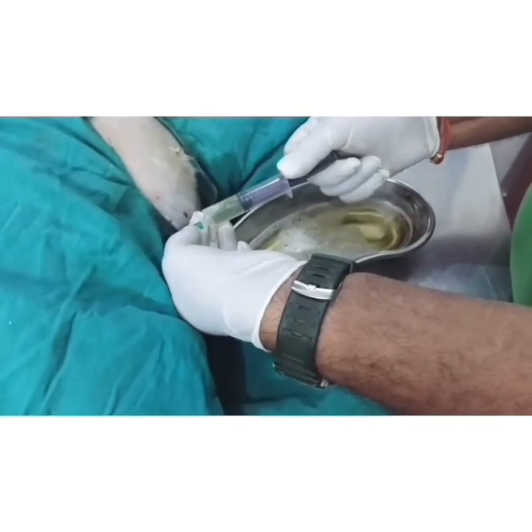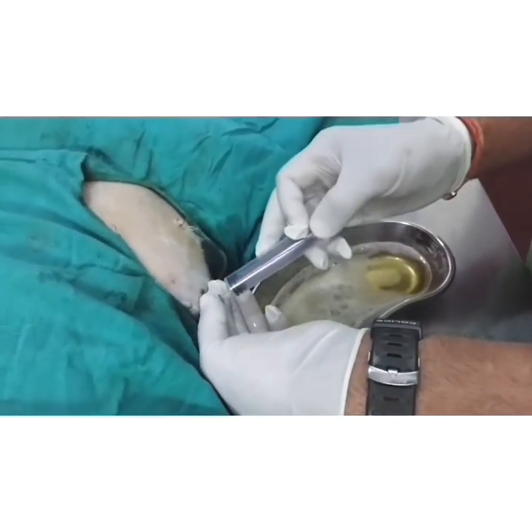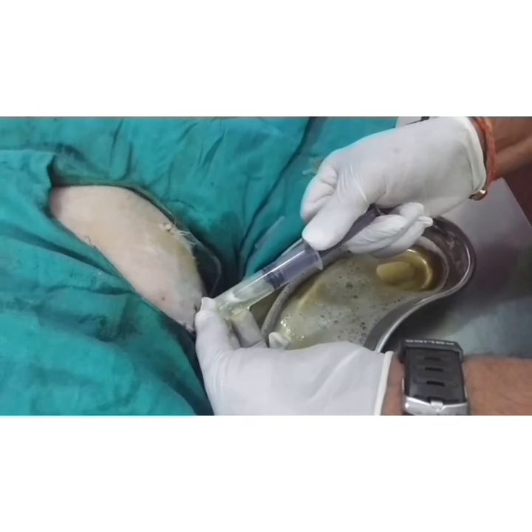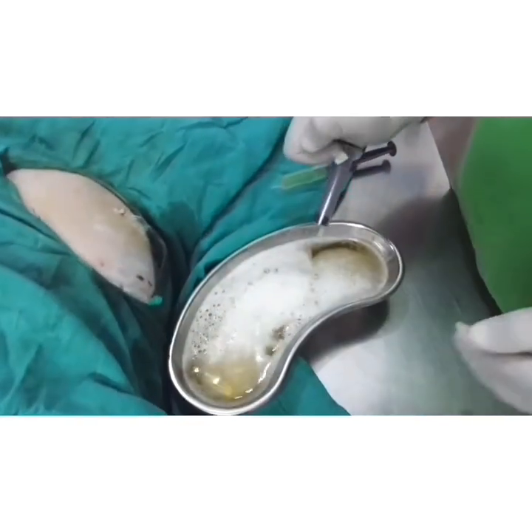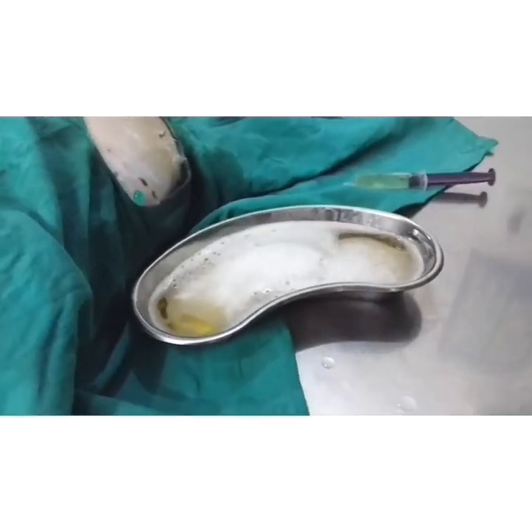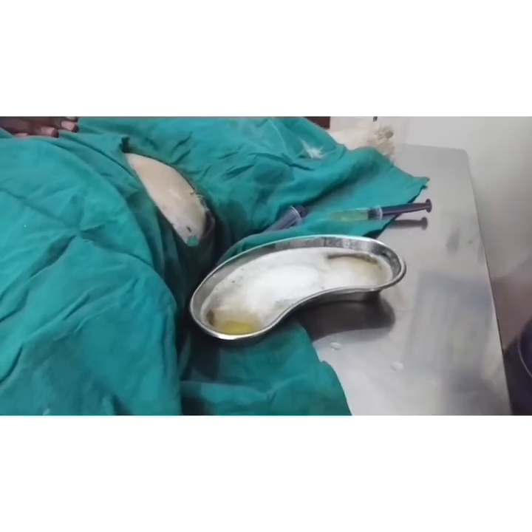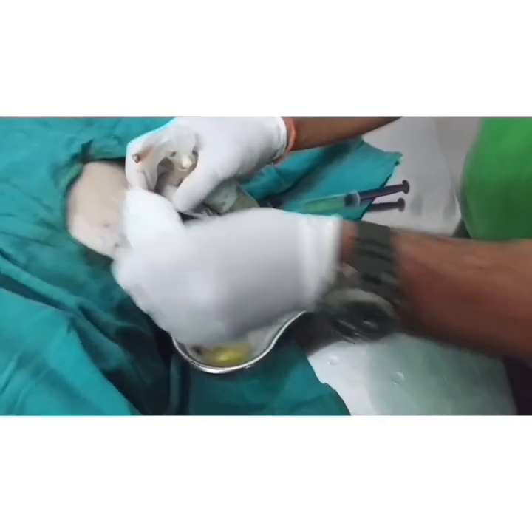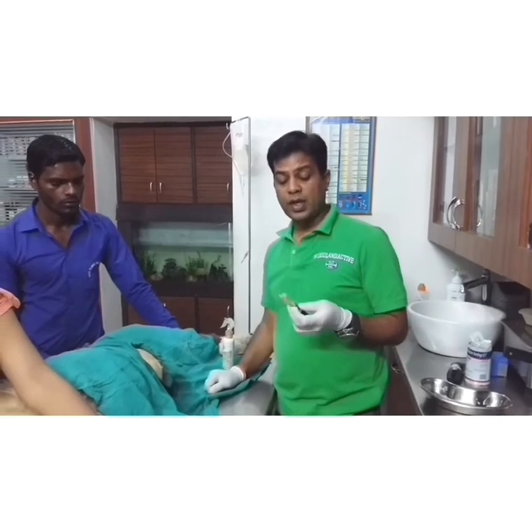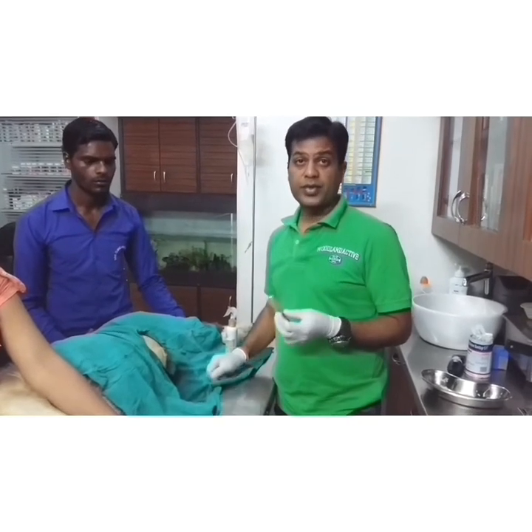The fluid is transparent and not turbid, so I don't think there is infectious peritonitis, and you can see it is very clear with no chyle. I have taken out about 300–400 ml of fluid. Now I will take the needle out and apply some antiseptic. With this fluid I will estimate the total protein, total albumin, glucose, cytology, and if needed I will do a culture.